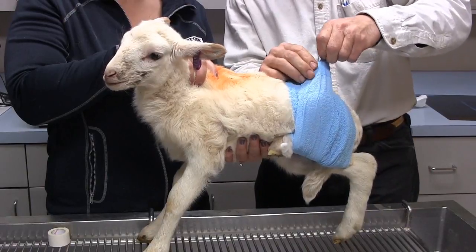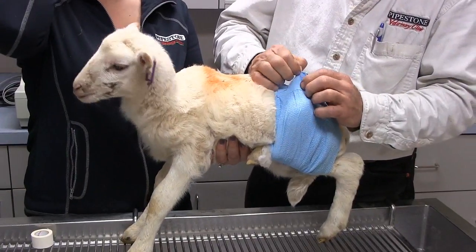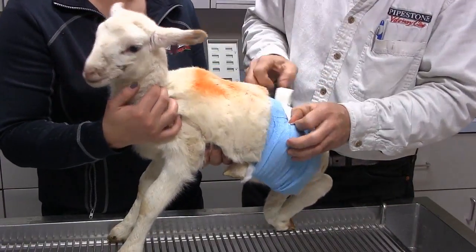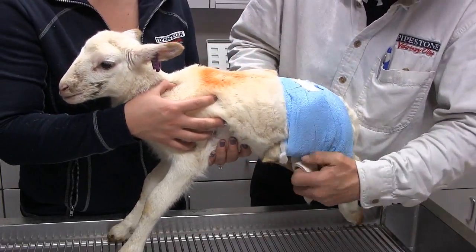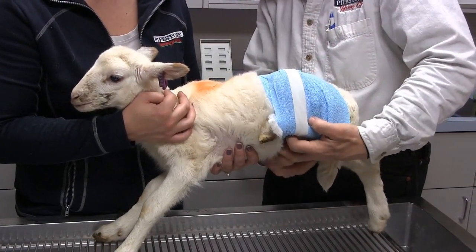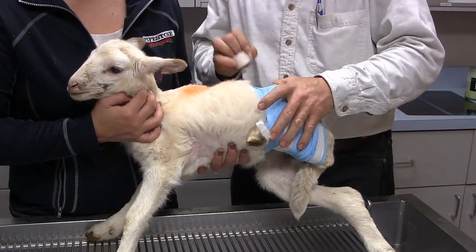The very end of a roll of vet wrap is folded over on itself, which is what I'm attempting to peel back. Sometimes it's just difficult to do, and maybe it's easier just to put a little white tape on. So typically in this situation I would put enough white tape on to make sure that the bandage doesn't slide forward nor rear. So I went way back by the hock, way towards the front by the foot.